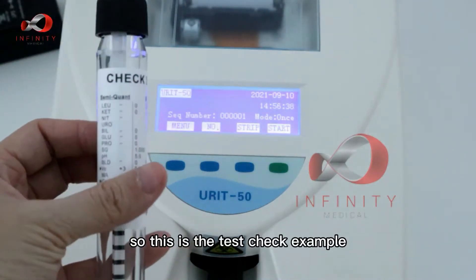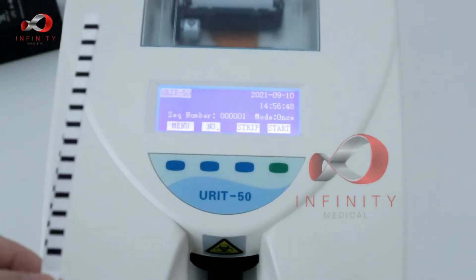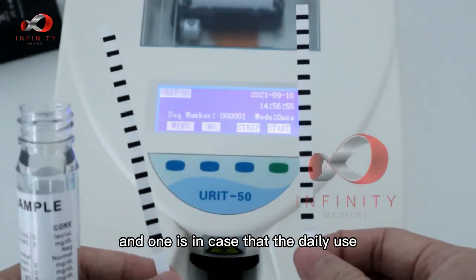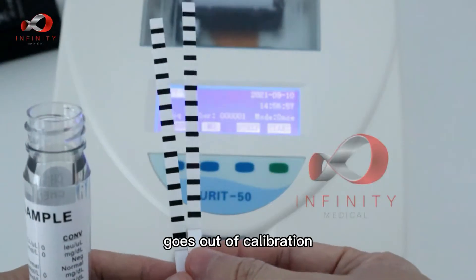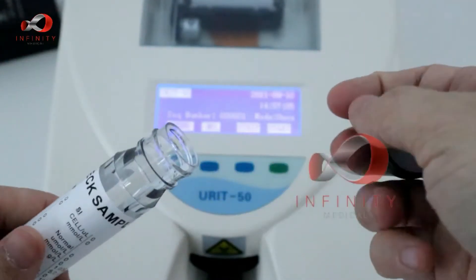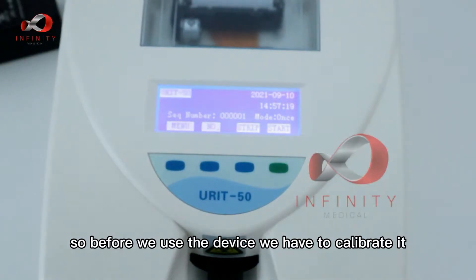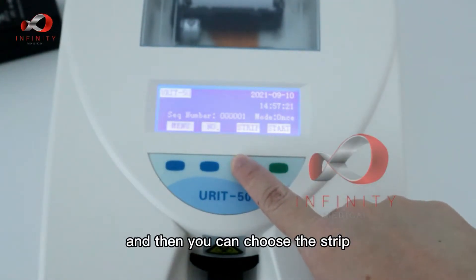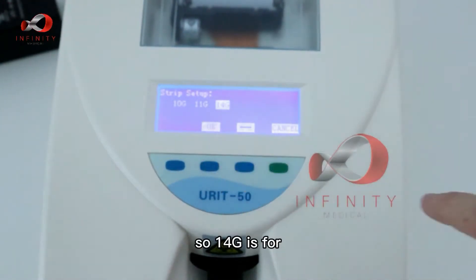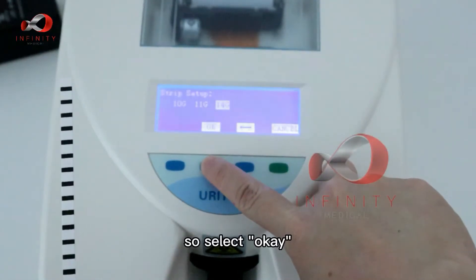This is the test check sample used to calibrate the device. There are two strips inside — one is for daily use and one is in case the device goes out of calibration. Ensure the strips do not get wet; keep them in the bottle. Before use, go to the calibration menu and select 14G, which is the calibration strip, then press OK.